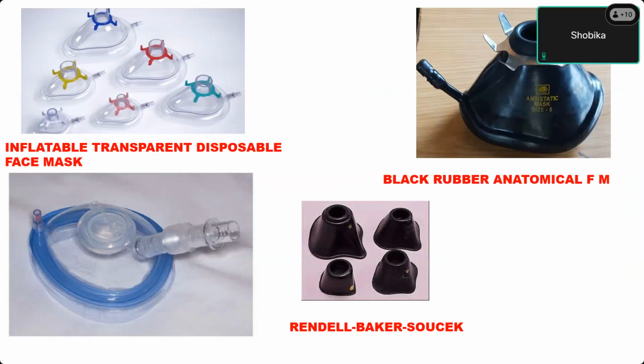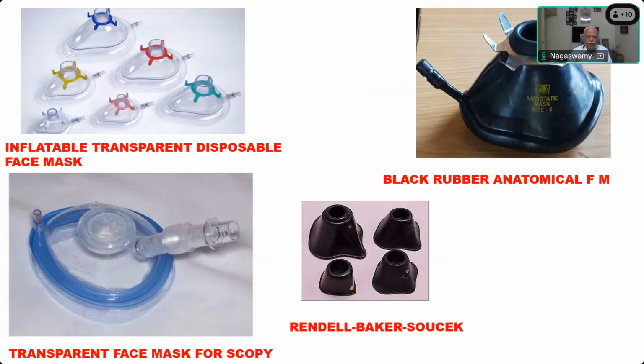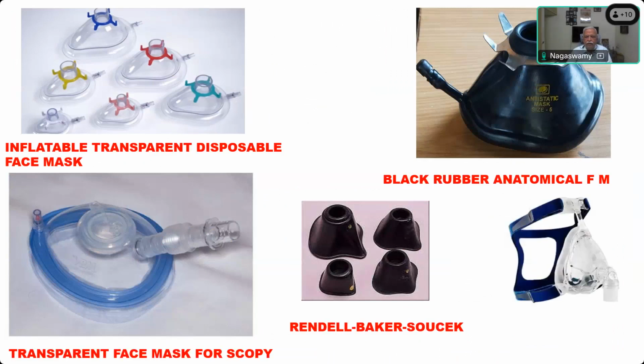For endoscopy, sir. This is a transparent face mask for scopy. Okay, so you can use it for scopy along with that. And what is this mask for? For non-invasive ventilation, sir. BiPAP mask, sir. Okay, CPAP mask, very good.